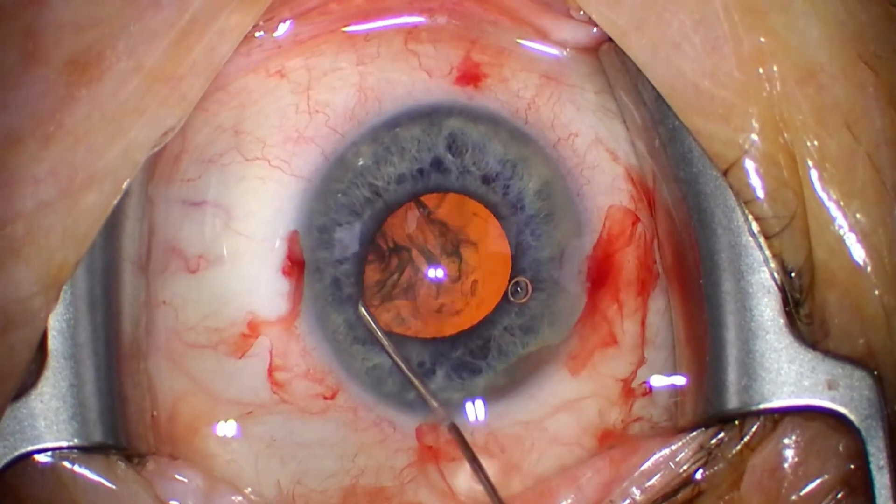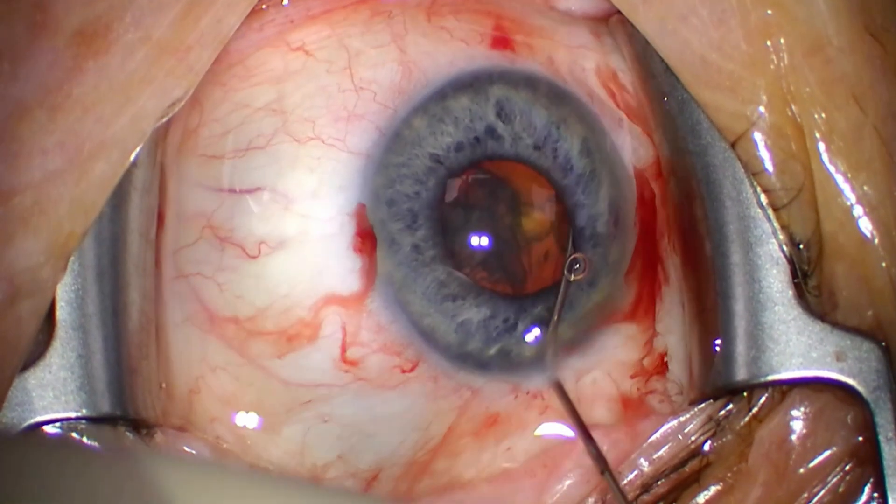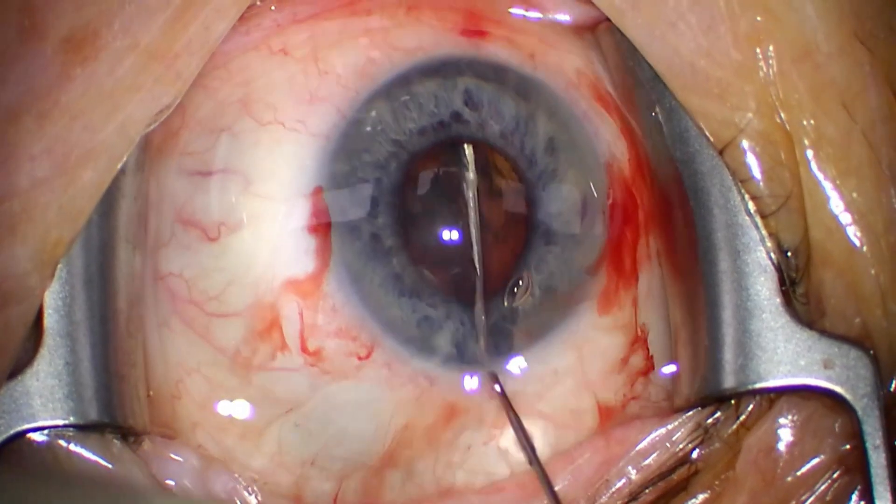I'm already aware of that — you can see I'm releasing some BSS behind the lens and redoing it. And now you can see iris prolapse happening here. What do we do in these situations? Do we just go out and try to push the iris back in? No, we don't. It's very important to think about what's happening pressure-wise. We have a lot of pressure from that lens going forward, and just pushing the iris back in will not help — it'll just create holes in the iris.